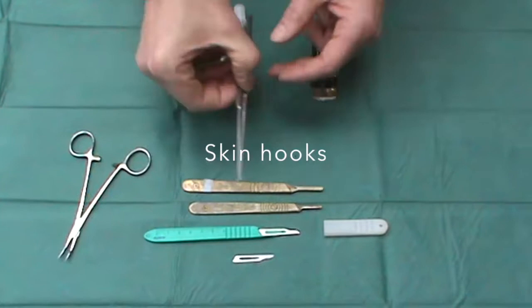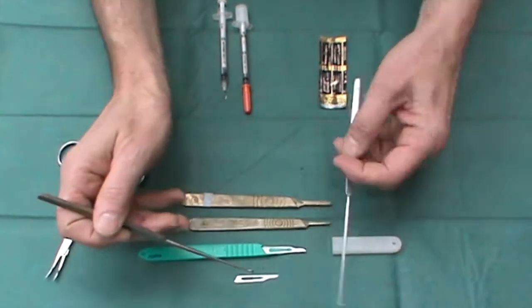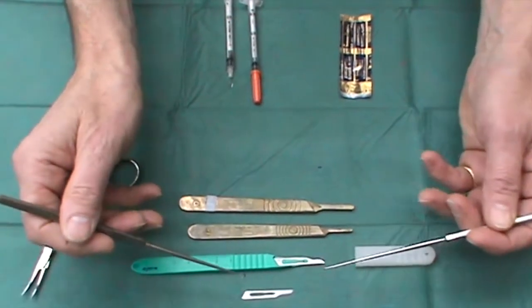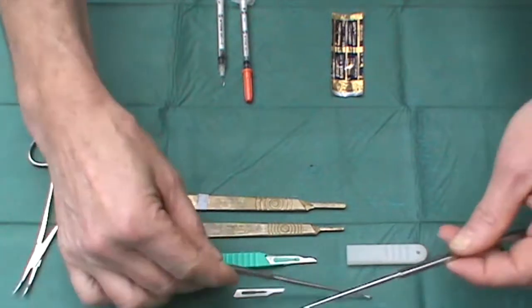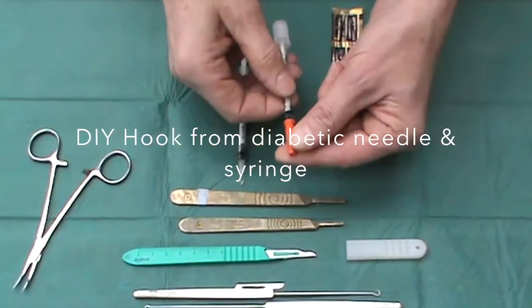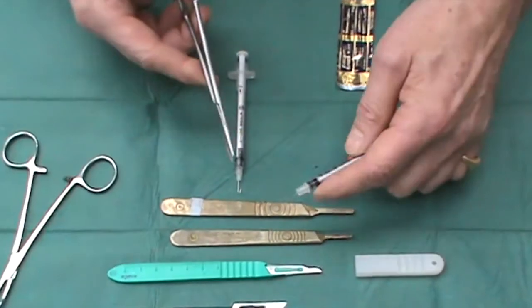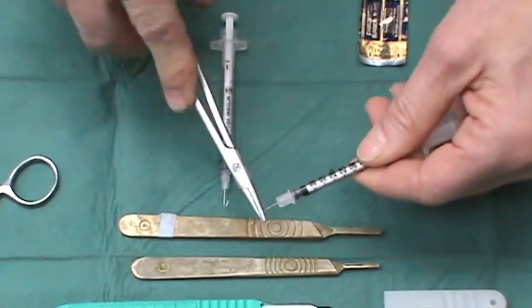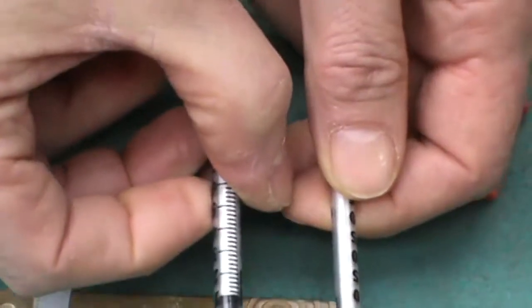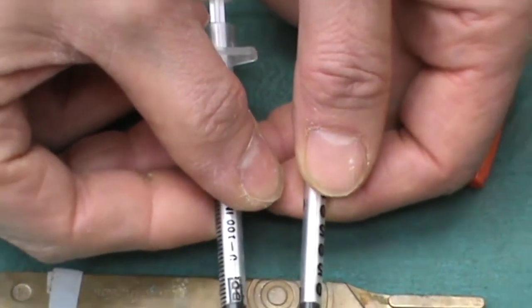I also like to find a pair of skin hooks in my operating set, because these are so useful for being able to pull out tissue, lift up the specimen you're taking out, or open up the wound in order to see what you're doing. If you don't have a pair of skin hooks, it is possible to make your own DIY skin hook quite simply with a diabetic syringe and needle, whereby you apply it, turn through 180 degrees, and you now have a skin hook. This is very good for delicate tissue — for instance, on the face — but easily broken if you try and use it on heavier tissue.